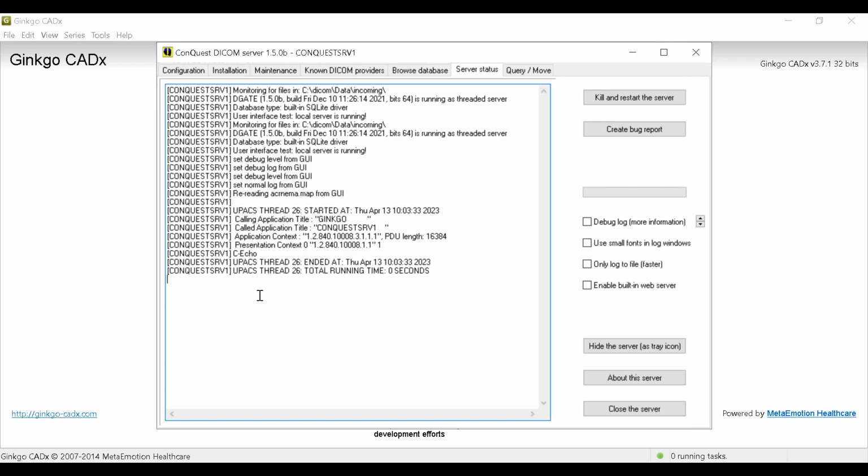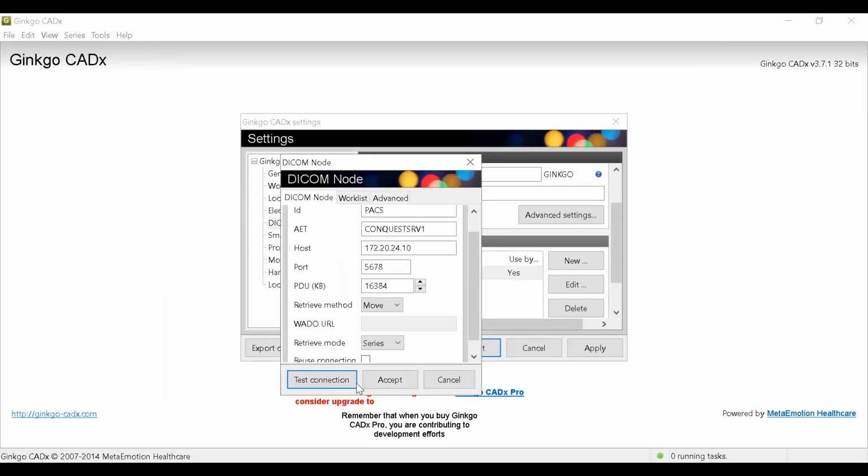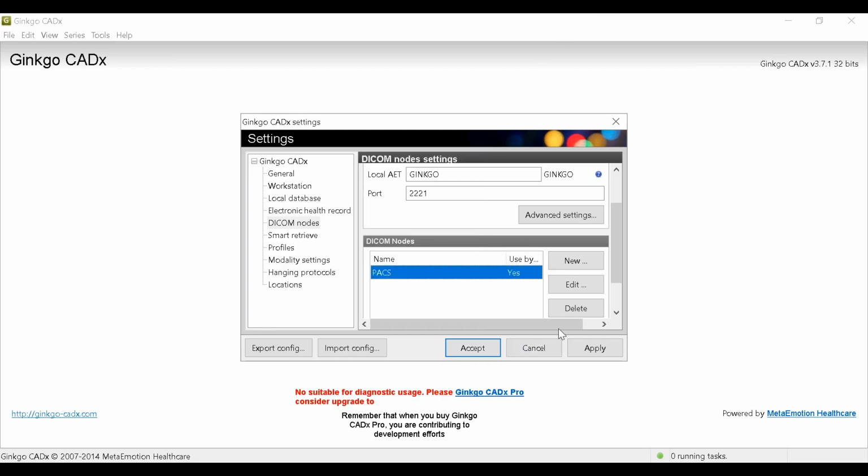The DICOM software is actually running as software. It's layer 7. So there's a lot of things going on. It's more like, hey, check to see if I'm on your list. Make sure you understand my AE. Make sure you understand my IP. Make sure you understand my port, and then send me back a confirmation, please. That's a little bit more detailed, isn't it? So that's what we're doing here, and this is confirmation of that. Well, guess what? If I've got this successful, then that tells me that I can actually query things from my archive. But notice it doesn't say that my archive can flip roles and send back to me.